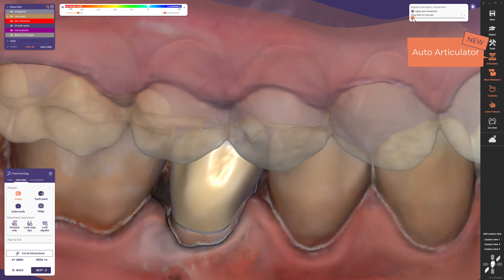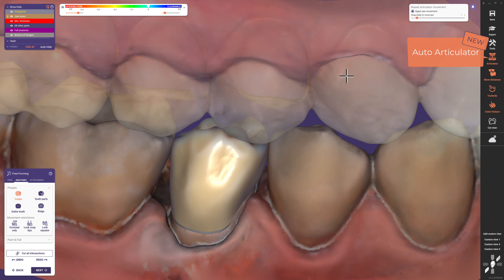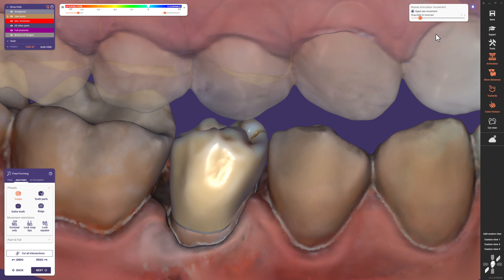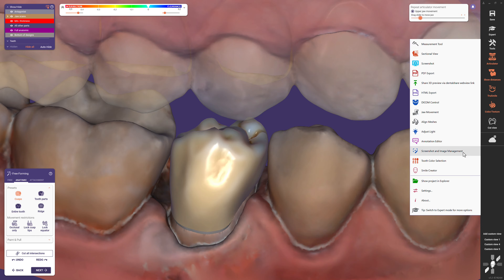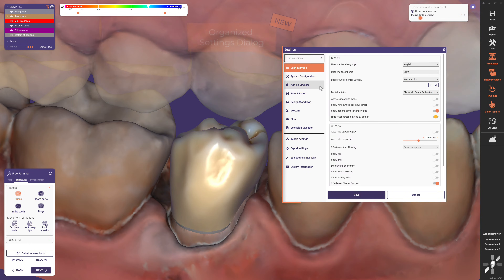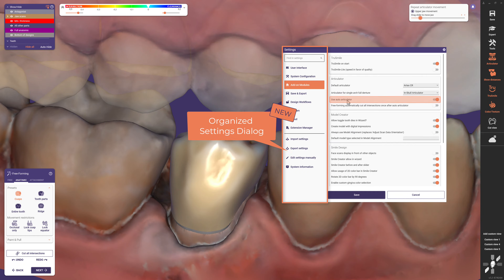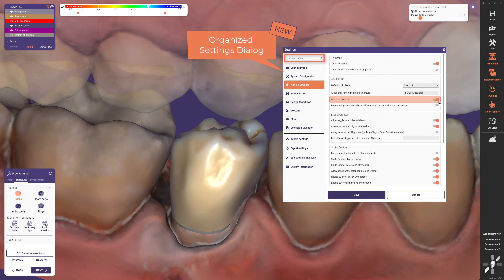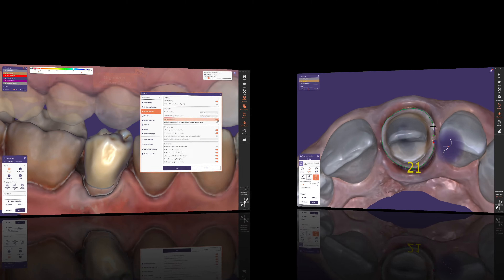If you like to add this time saver to your everyday work, just activate the checkbox in our new settings dialog, where you can find everything structured in groups, including a search bar to jump to the setting you are looking for.